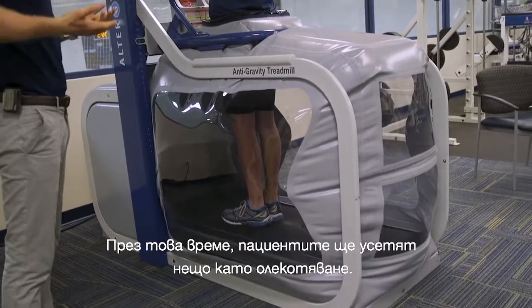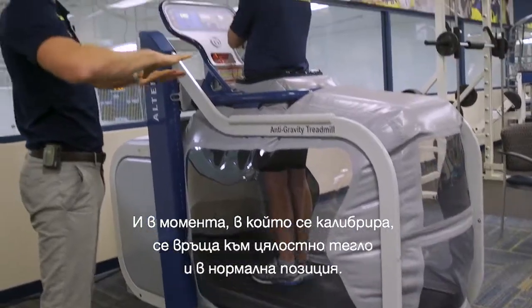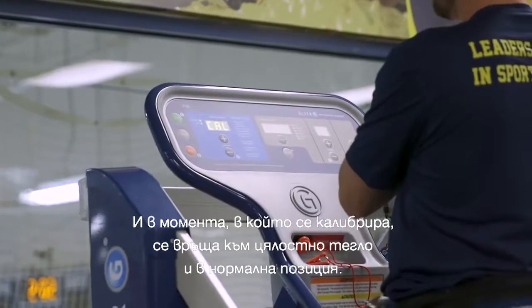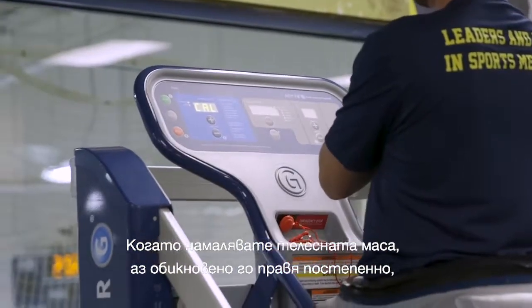The patient will feel like they're getting elevated and lifted up during calibration. Once it's calibrated, it'll take them back to full body weight, basically at a normal stance. As you decrease the body weight, I usually do it incrementally and allow the patient to get used to that level.